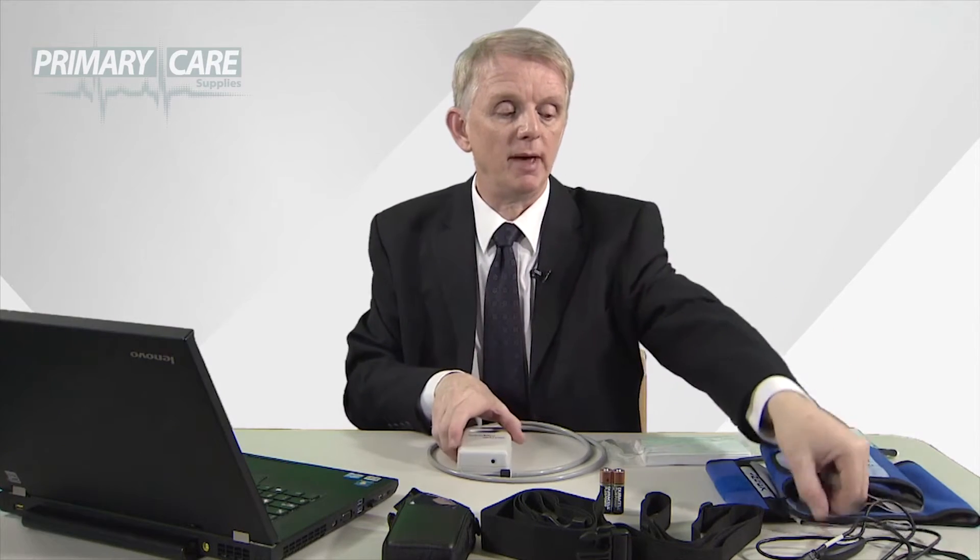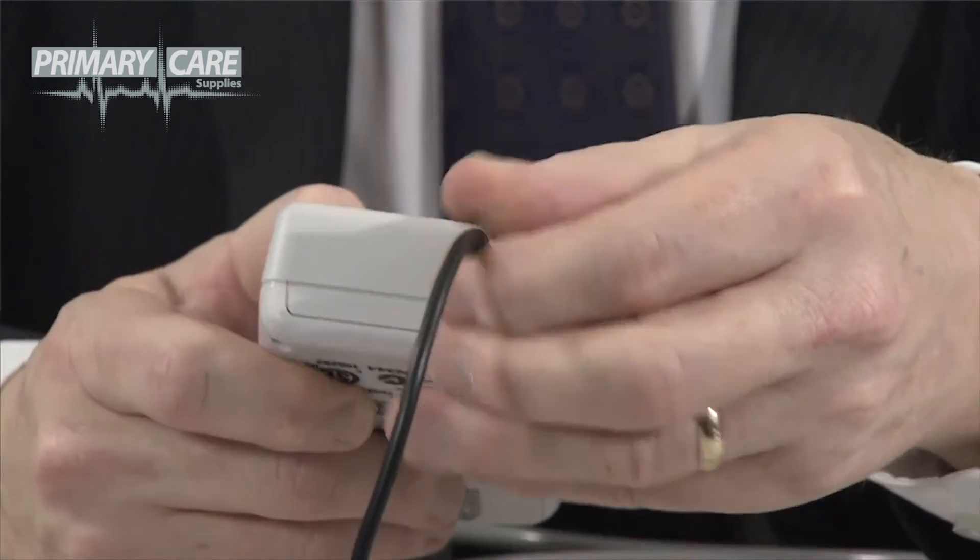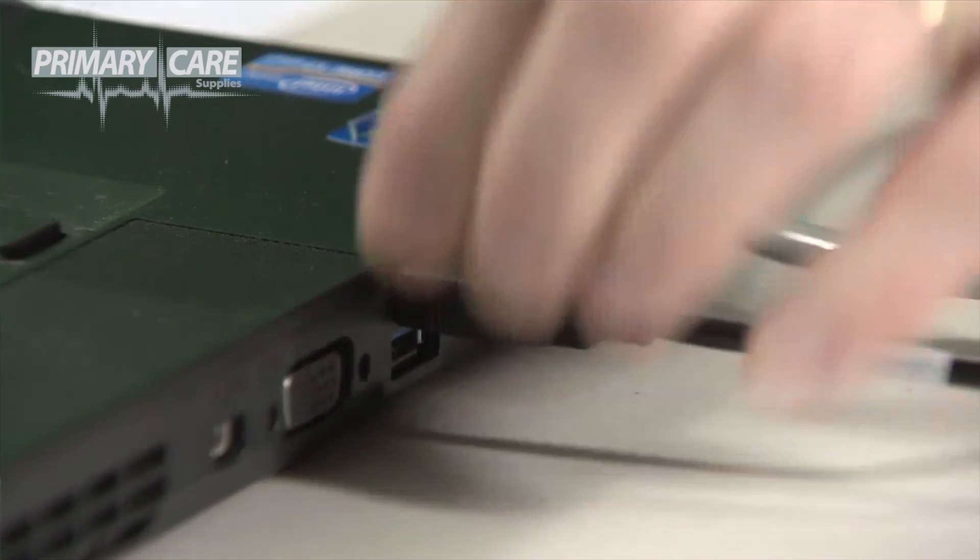Connect your ABPM unit to the USB interface cable. The cable goes into the bottom port on the unit itself and then into the USB port on your PC or laptop.